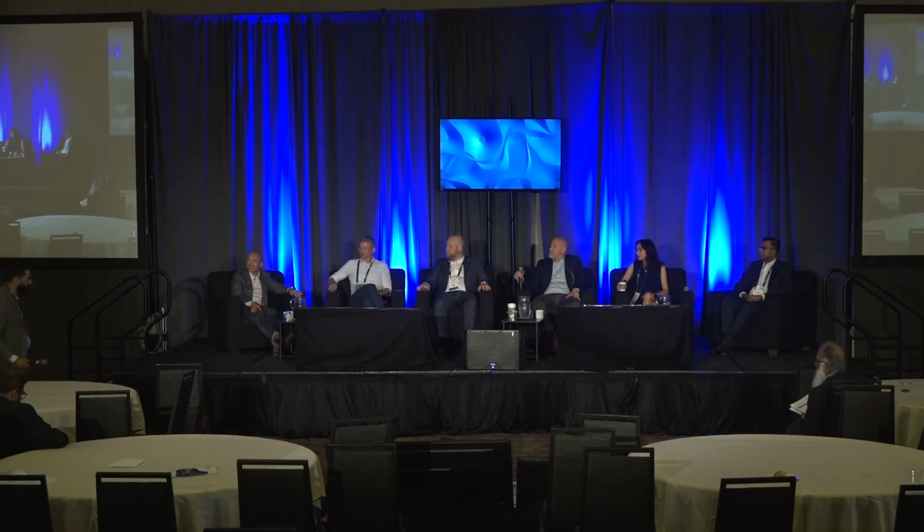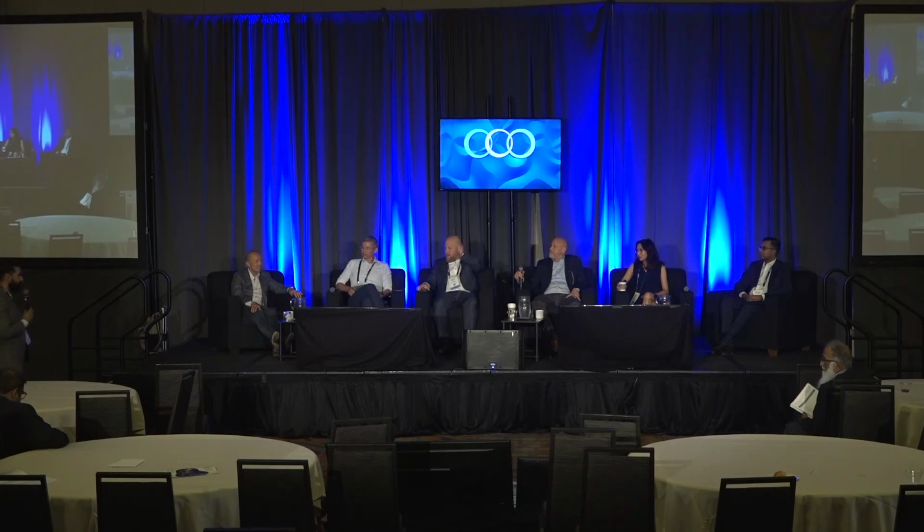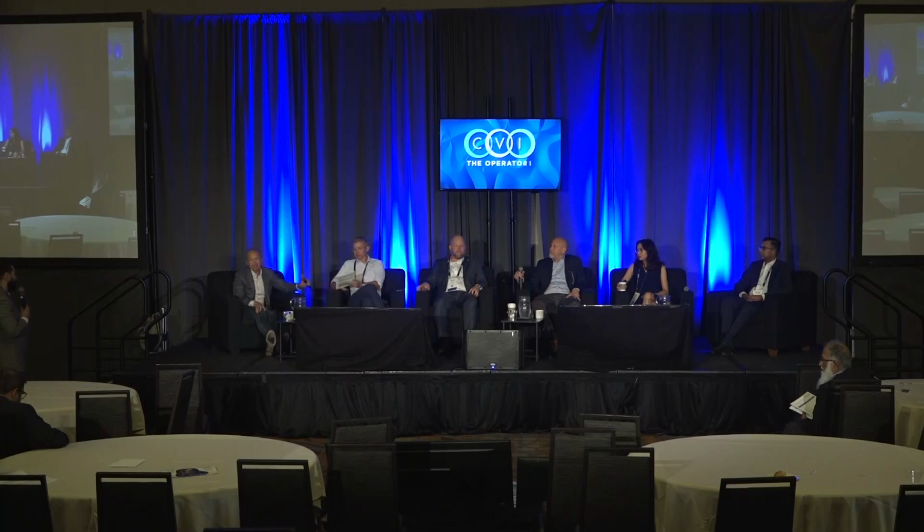Yeah, agreed. If this were through the groin, we would have balloon sized once we saw that on TE imaging, but it was just not possible from the neck. Everything was prolapsing, so I figured a balloon would cause us more trouble. Less touch is more, because you can also tear these inadvertently. Okay, we should probably move on.